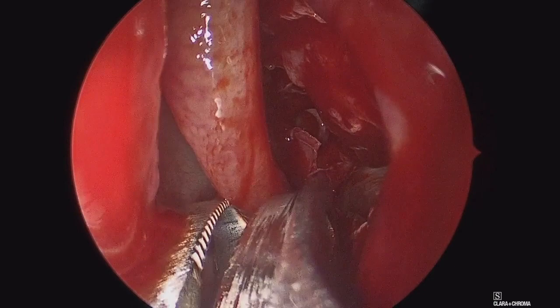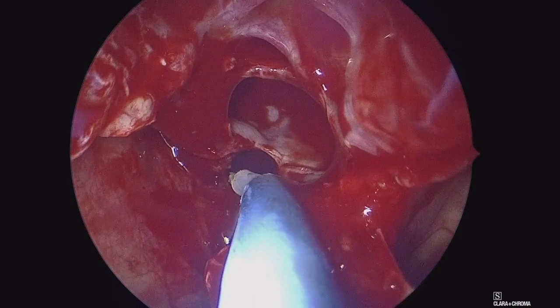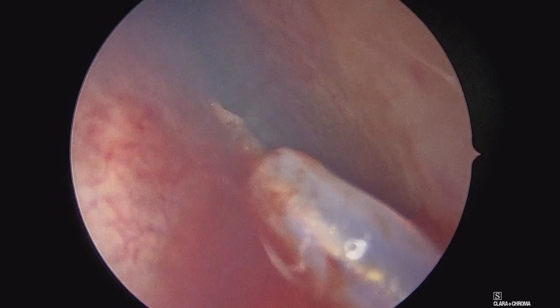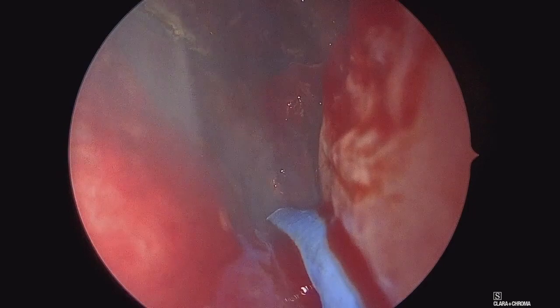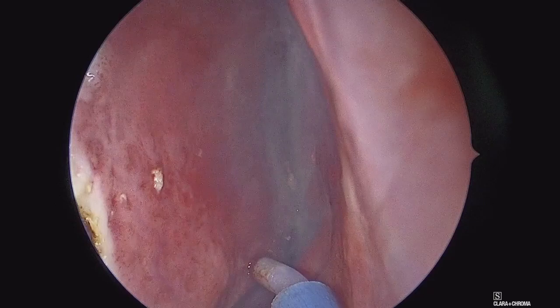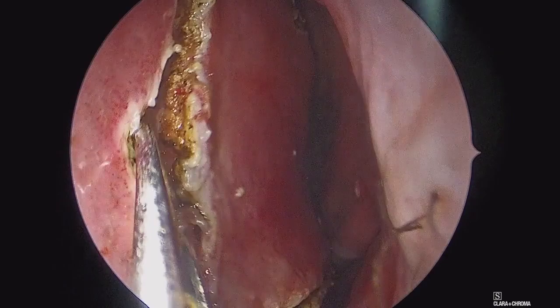Here we are trimming the middle turbinate after opening up the left maxillary sinus, then opening up the left sphenoid sinus as well. In this case, we elected to raise a nasal septal flap on the contralateral side, as we had a suspicion that we would at least expose dura, if not cause a CSF leak. Here we are raising that flap up front in order to facilitate access by completing a posterior septectomy, which allows significantly better bilateral access to this particular tumor. Once this flap is raised, we can tuck it into the left maxillary sinus and keep it out of the way, as opposed to tucking it into the nasopharynx — which in this case is needed for tumor dissection.